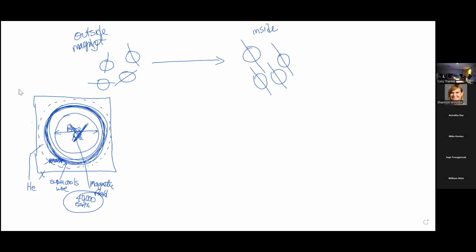So if you're a cardiology fellow or a radiology resident or a nurse, the stethoscope comes off. Okay? All of those things. Something else to keep in mind, you don't want to take your credit cards in there because it's going to erase them. You don't want to take a computer in there. It's going to erase the hard drive. People get their computers stolen, and one thing that bad guys do is they take these laptops up next to these MRI scanners and wipe out the hard drive. You get to start all over again. So we want to keep that in mind. That's one reason that it's in the room, but not the primary reason.